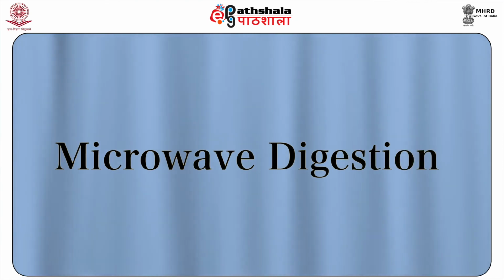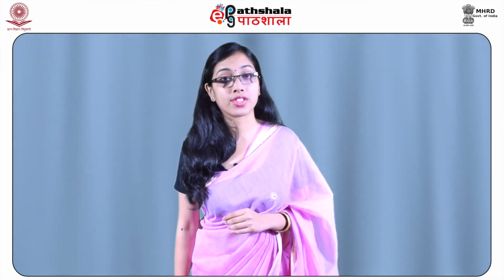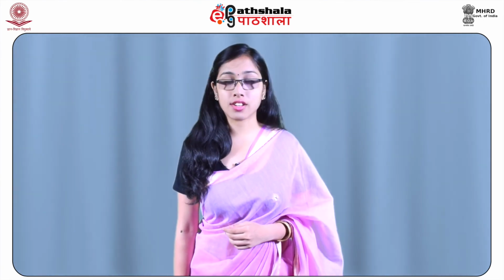The next technique we will study is microwave digestion. Matrices are digested with acids or alkalis in a microwave oven to facilitate the isolation of inorganic poison in organic matrices under a specific analytical condition of operation, that is, the operation of the oven at a specific microwave power for some time. The interaction of microwaves with matrices results in production of heat with rise of temperature, by which the digestion occurs.